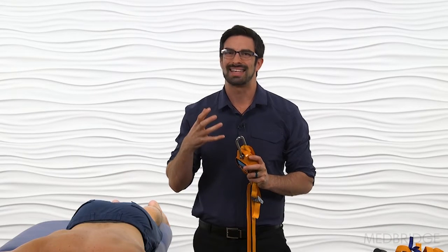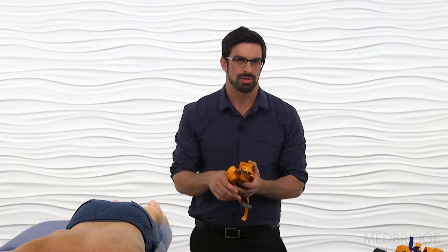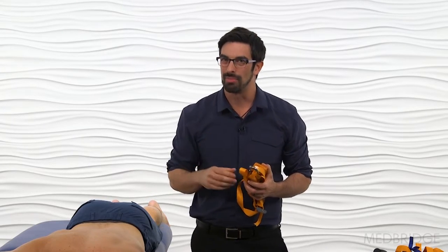Generally we're looking for greater than a 10% difference in strength between sides. Now, if you don't have this crane scale, you can use a standard dynamometer from the clinic.